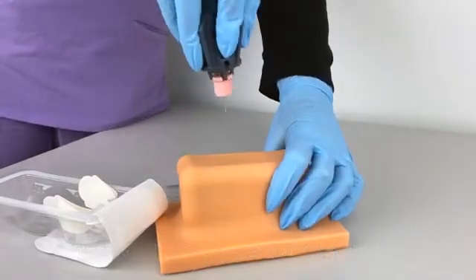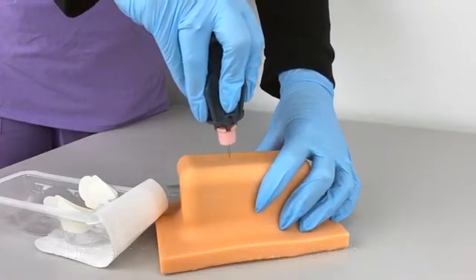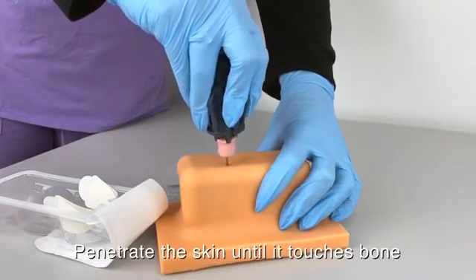Place it at an angle of 90 degrees to the skin. Gently push the needle through the skin until it touches bone.